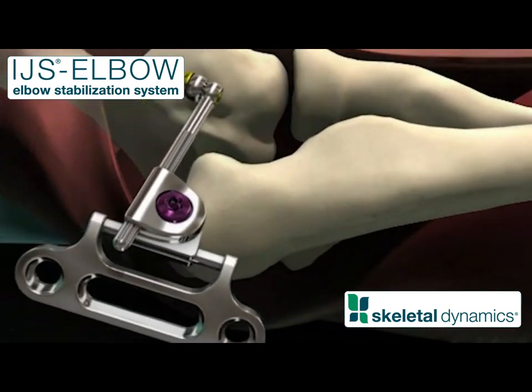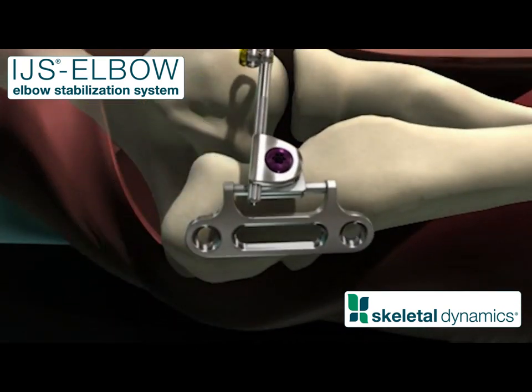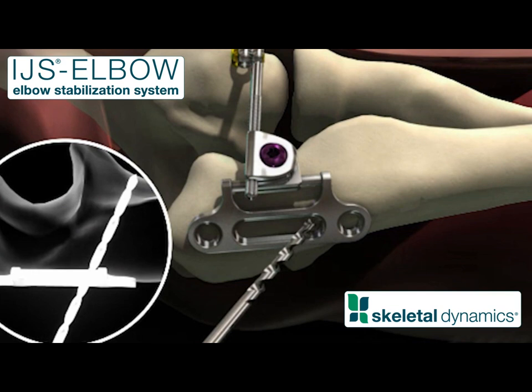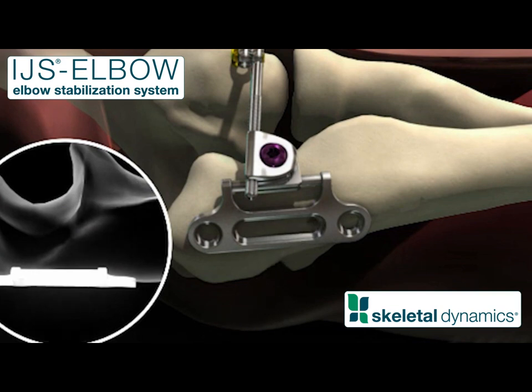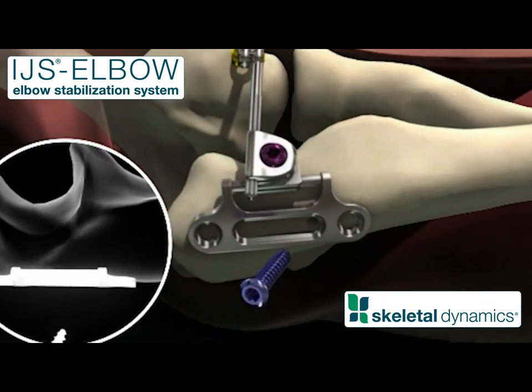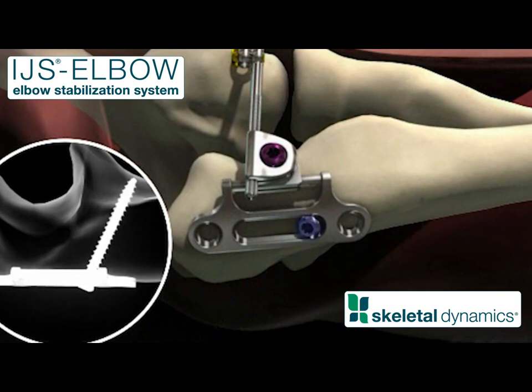Position the ulnar plate assembly on the posterior surface of the ulna just distal to the tip of the olecranon. Create a pilot hole through the sliding slot, angling towards the coronoid and away from the articular surface.